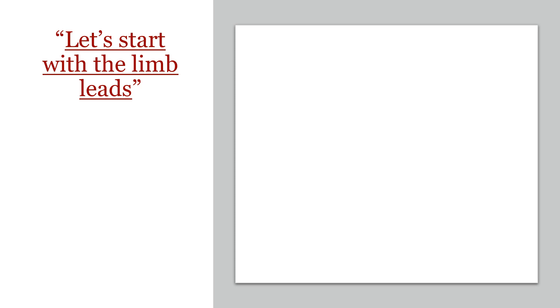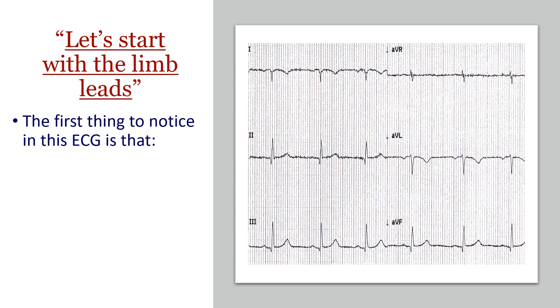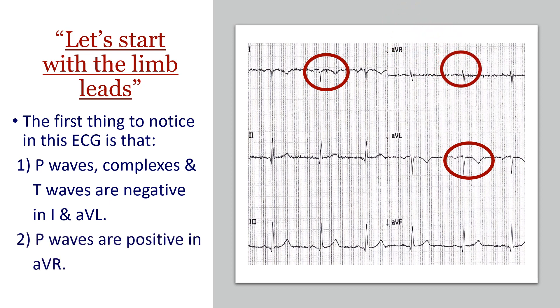Let's start with the limb leads and have a close look. The first thing you'll notice in this ECG is that the P waves, the complexes, and the T waves are all negative in lead I and AVL, which is abnormal. The P waves are positive in AVR, and lastly there is a right axis deviation.